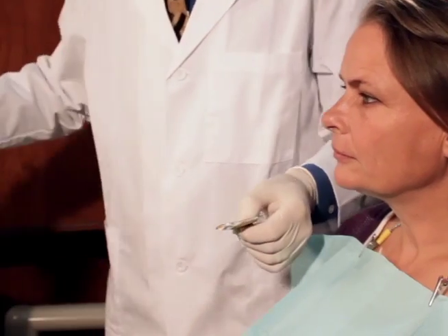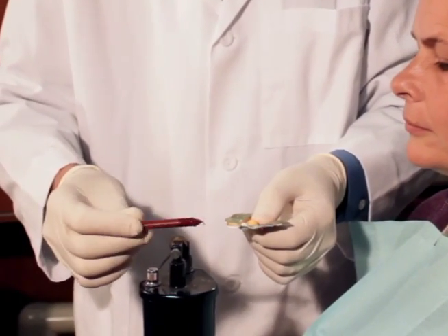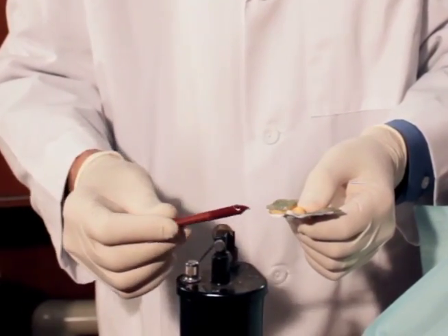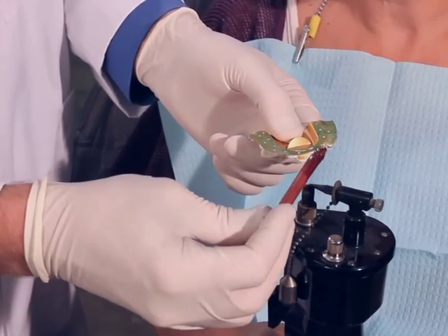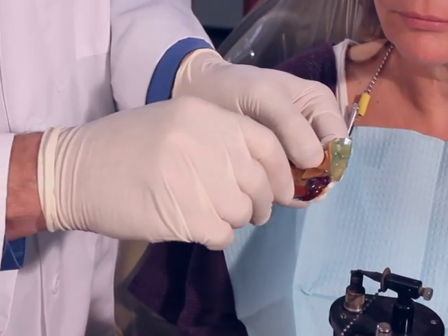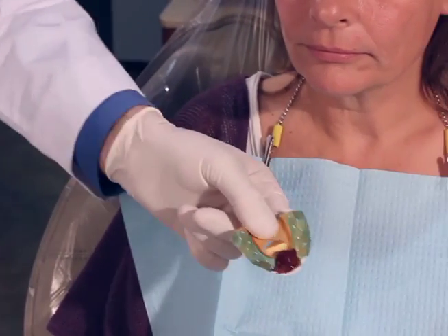I'll go ahead and have the patient hold my torch while I heat up some more compound for an anterior compound jig on the bite tray. A little dab won't do you — get a nice section heated up really good. And just as it starts to slump, come right over to the tray, smoking hot. You want to come right out to the front of the tray because that's where they're going to be biting edge to edge. We'll go ahead and temper this in hot tap water so we don't burn the patient.